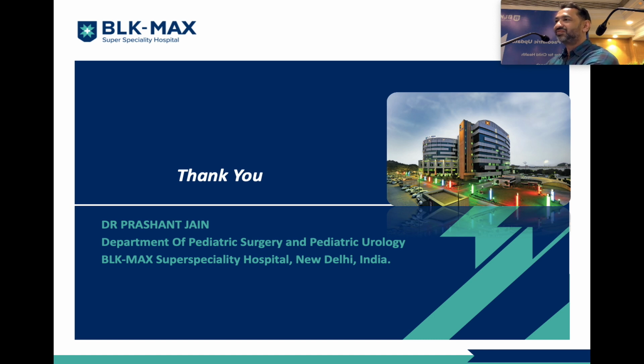Thank you, Prashant, for your excellent presentation. I just want to add one or two things. One is, in plain X-ray, you cannot ignore foreign bodies. Even nowadays, the Chinese button batteries, magnets and all are diagnosed with an X-ray. You can confirm only on X-ray. So that is needed more in diagnosis, and also in follow-up.